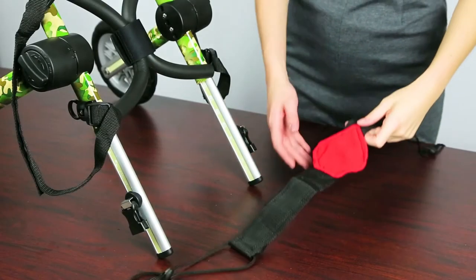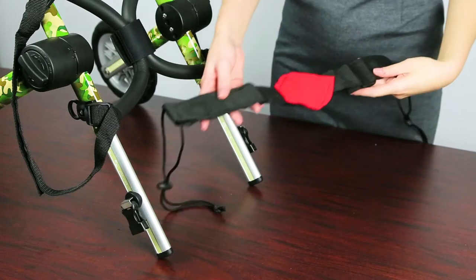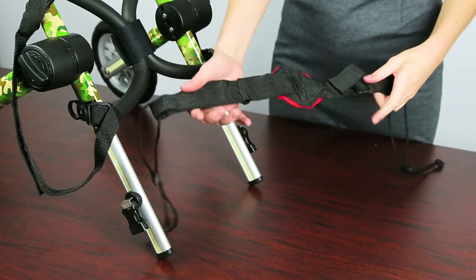There are two sides to the optional belly belt: a side with a loop and a clip, and a side with Velcro.